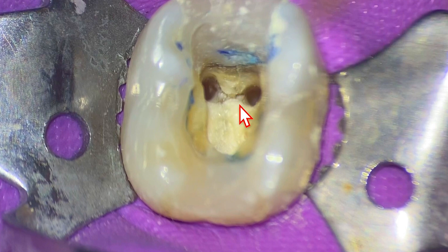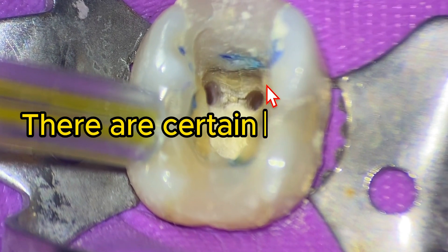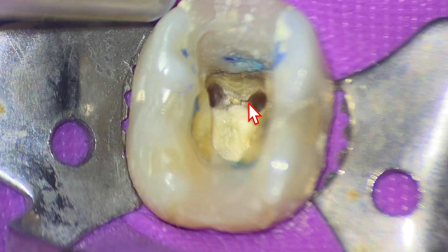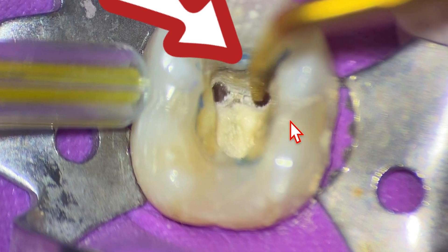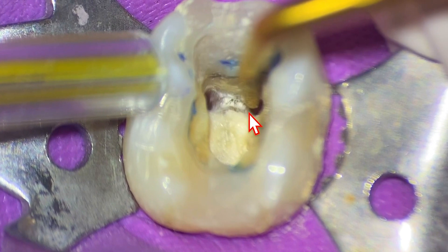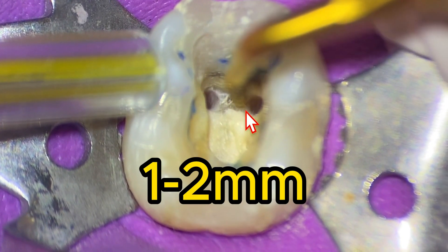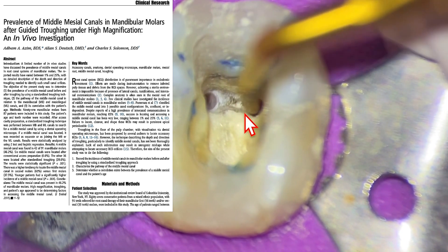The tooth is now dried, and what we're going to do is remove this material here. I don't normally use ultrasonics, but I wanted to show it in this video because there are certain advantages. One advantage of using ultrasonic for troughing is I can see exactly what I'm doing at the tip of that handpiece — there's no head of the handpiece in the way, like my slow speed when I use a munspur. So what I'm doing is troughing back and forth, buccal-lingual. I'm trying to keep to the mesial of the furcation with nice light brush strokes, going about one to two millimeters below the pulpal floor without perforating through it.